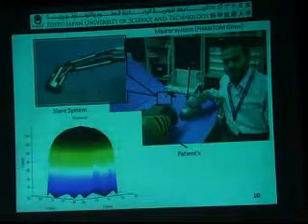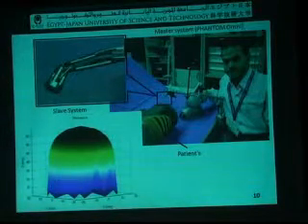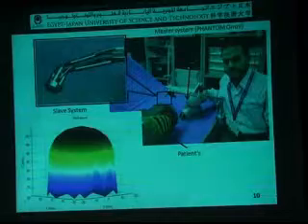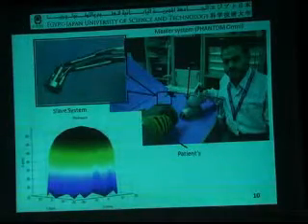And the workspace of the robot is very huge. It can cover 22 centimeters by around 30 centimeters. Very big working space. And here is some movie. I hope it works this time.